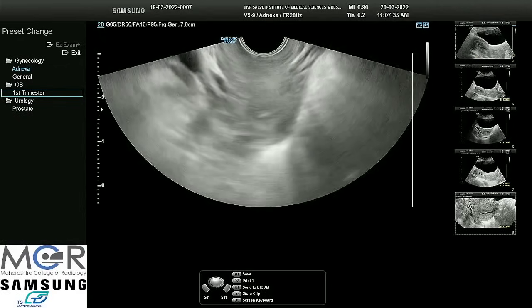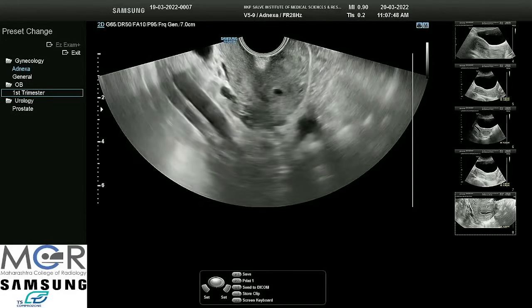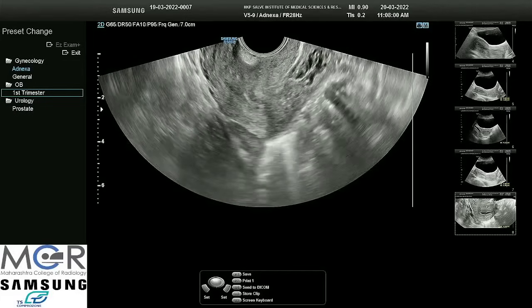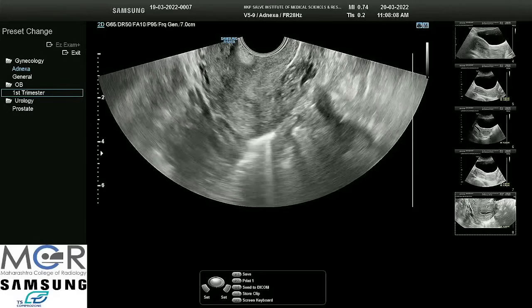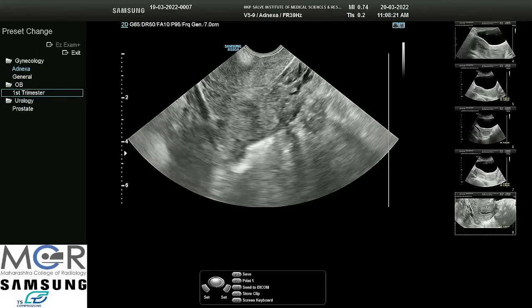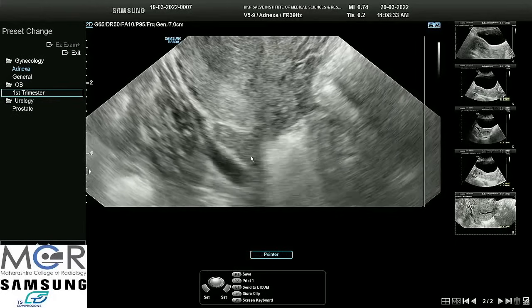Now we will enter one of the fornices. This is the long axis of the uterus, but now I am entering the right fornix. We can see the vessel and will try to trace the ovary in the right fornix. We are expecting to see the right ovary there. Now the focus point should be brought down where the ovary is, the angle of the probe decreased, the scan area decreased so that clarity of the image is good, and we can zoom the image. We can appreciate the ovary better. Ovary measurements should ideally be done in dual screen.